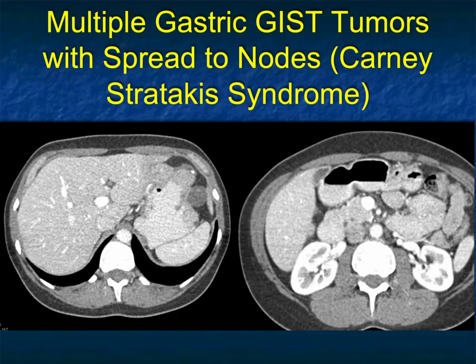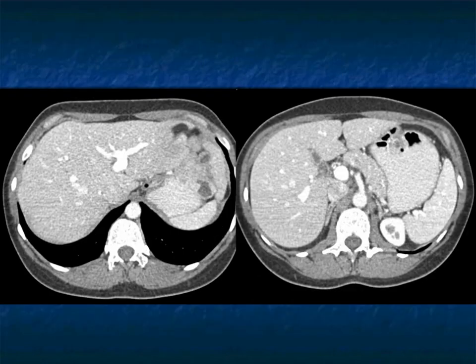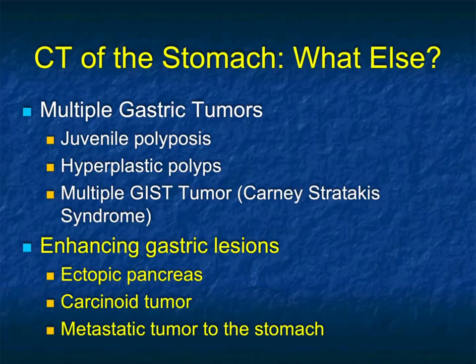Here are just a few more images of that patient. Not surprisingly, this patient underwent a gastrectomy. Multiple polypoid lesions, mainly off-the-wall exophytic — you've got to think about multiple GIST tumors.